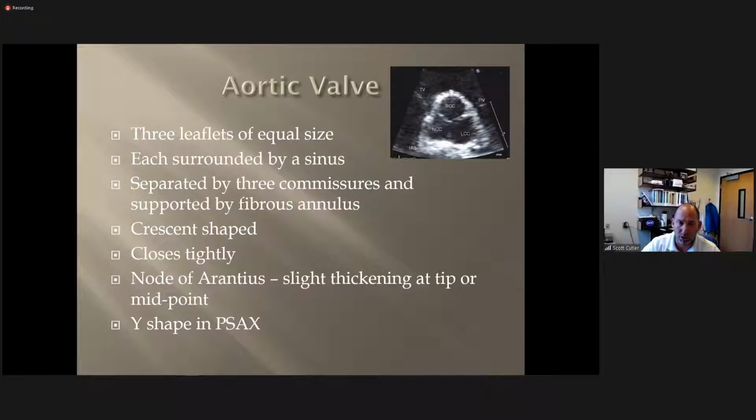So all those things are important to pay attention to. That's why when you zoom up on the valve, we want to make sure that the zoom is appropriate so that we don't exclude any of that information. We need to see the anatomy we need to see, have our reference, but be big enough to get the detail resolution that we need. And 2D is not enough for that. If we don't see it in 2D, you might still see it in color Doppler. So seeing the color Doppler covering the same area is also important. So know your normal anatomy.